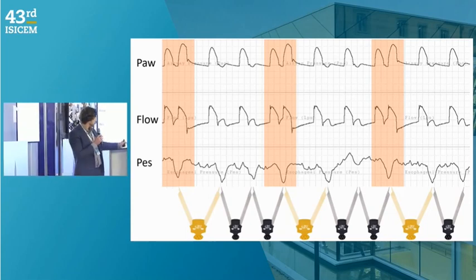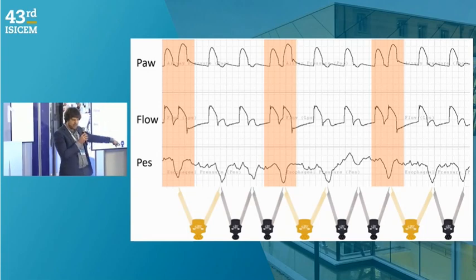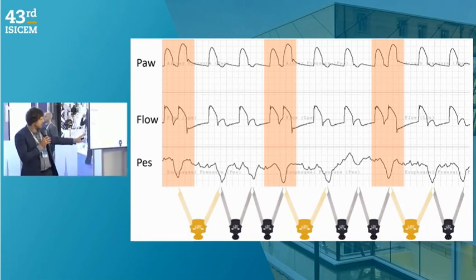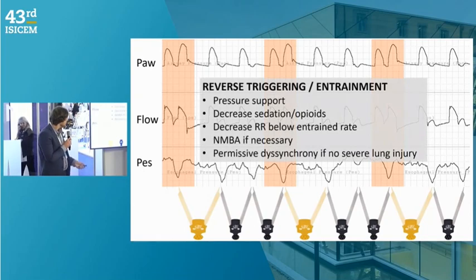So you have 2 sets of fixed intervals. One is when the effort actually transmits into a volume delivered, and one when it doesn't. But these are quite literally copy and paste, these are fixed intervals between each effort there. And so this is very much a rhythm, a pattern that you can pick up just by watching the waveform.